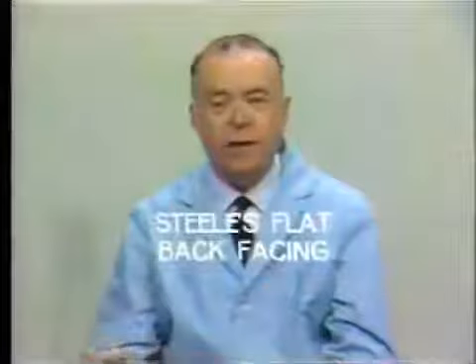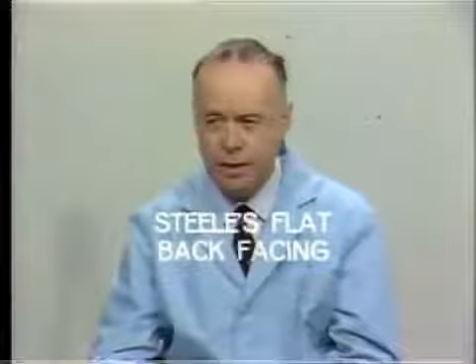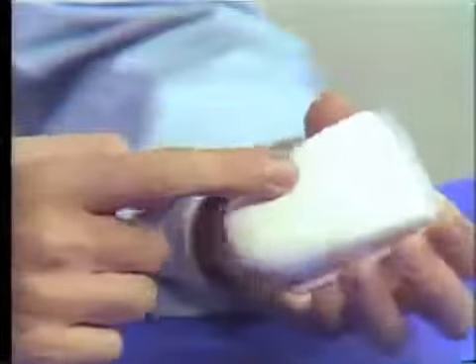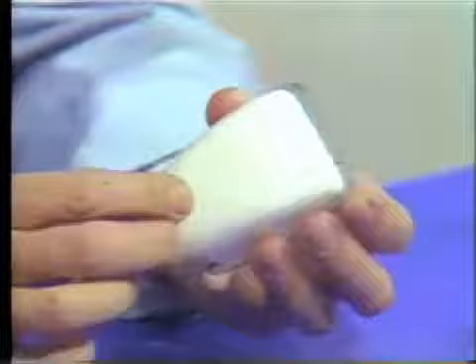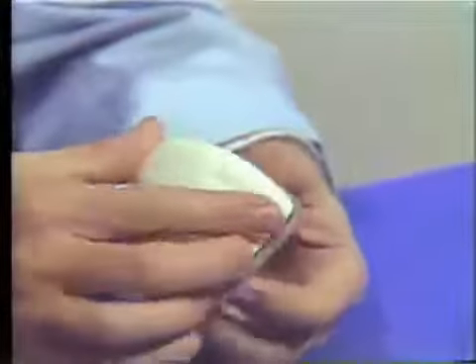The Steele's flatback is another type of Pontic which utilizes a prefabricated facing. And this model which I've got here, I think, illustrates the principle of the Steele's flatback quite nicely. The facing here, which can be either normal porcelain or vacuum-fired porcelain, or can be resin facing, slides on a precious metal backing. This is an enlarged model, of course, and the method of securing the facing is to cement it in position on the backing.